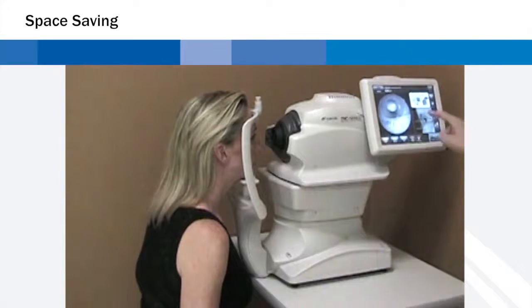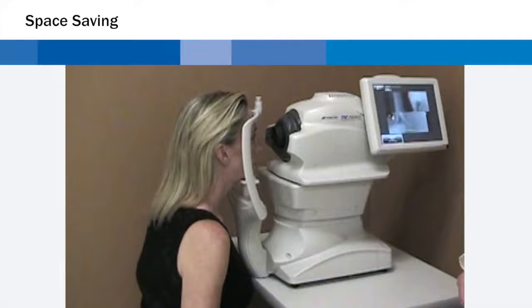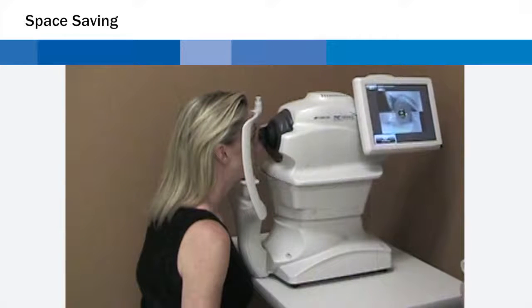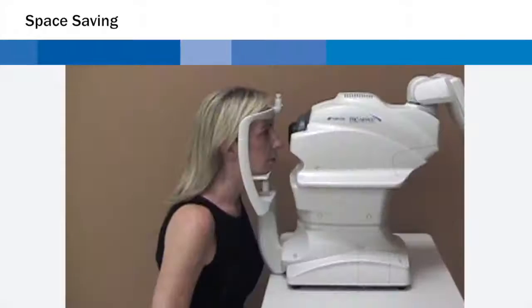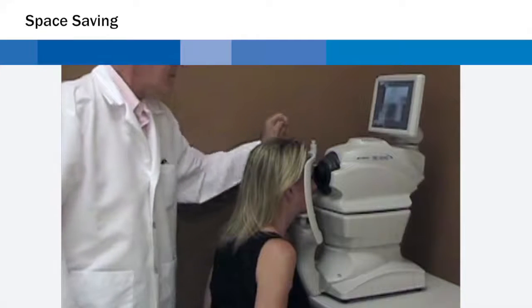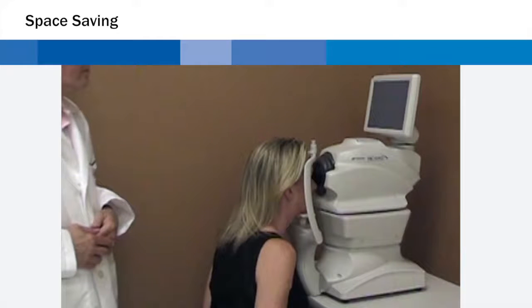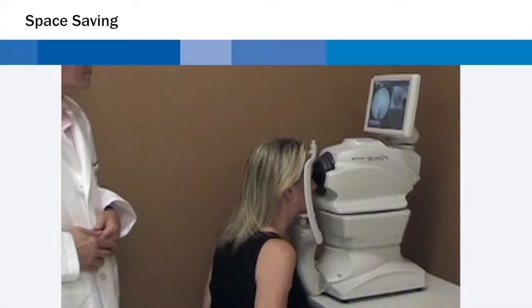The Topcon TRC-NW400 offers a perfect solution in a limited space. With a rotating touch panel monitor that allows operation of the instrument from virtually any angle, the photographer can be in front, behind, or at either side of the patient, optimizing space saving. The TRC-NW400 can also be comfortably operated when located against a wall or in a corner.